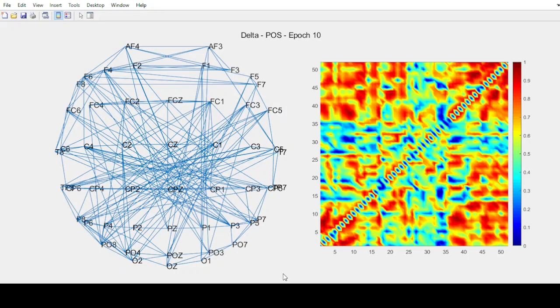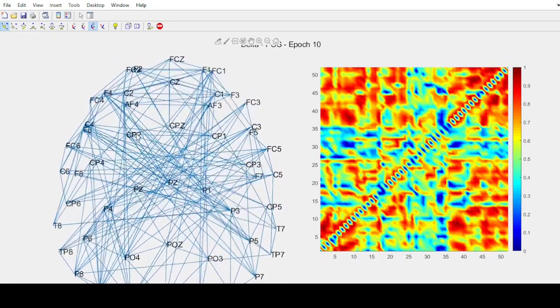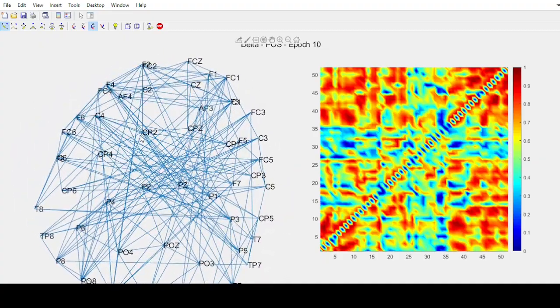During this session, we notice the graph representation changes for each epoch. In the last one, we see the EEG channels talking to each other through a connectivity measure. This conversation is dynamical and can be analyzed by its three-dimensional representation or by its two-dimensional representation, different levels of information.